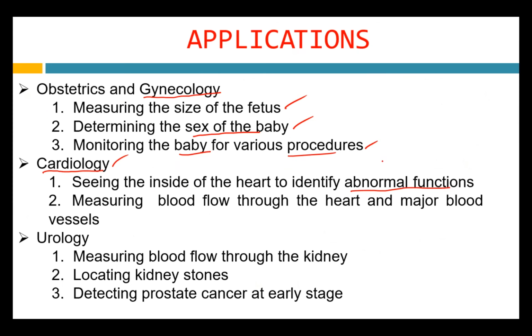It won't create radiation. So to see inside the heart, they'll go for ultrasound, but the exact positioning or exact diagnosis cannot be done as with CT or MRI. But you can at least see if there is a tumor, as even ultrasound can detect a tumor.